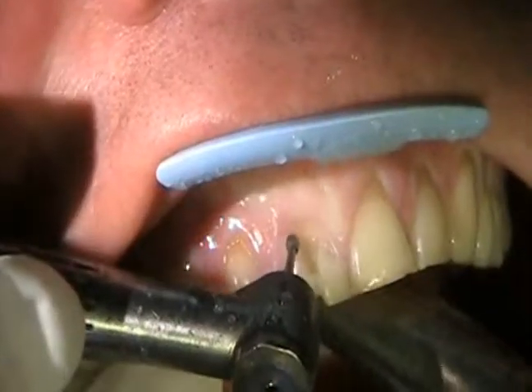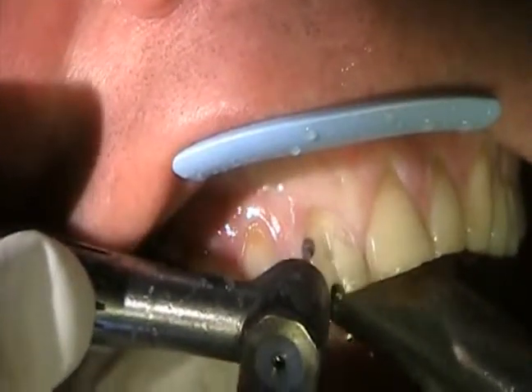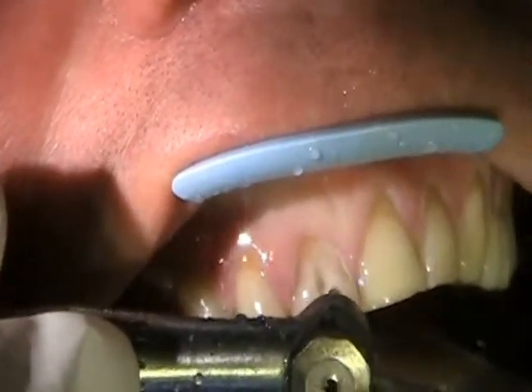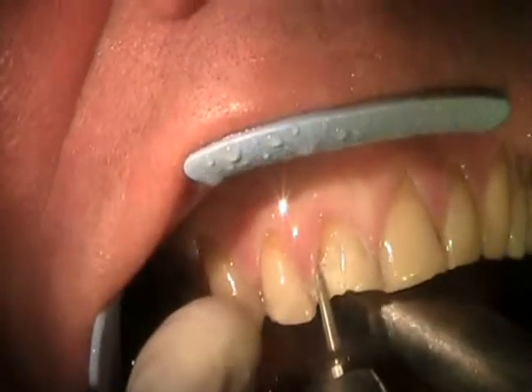It's very important to make sure that we've got enough enamel removed, and no more than that. We have to have enough depth of porcelain to make them look beautiful. We like to have that inner translucence, and we can't do it just by layering a thin layer of porcelain over that.